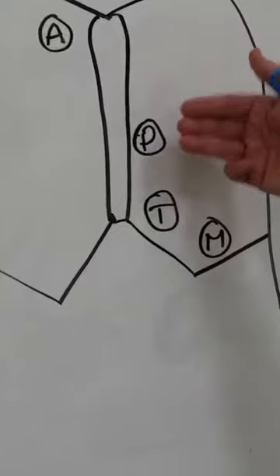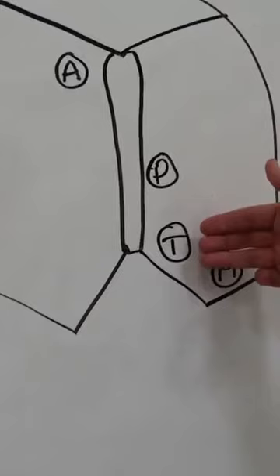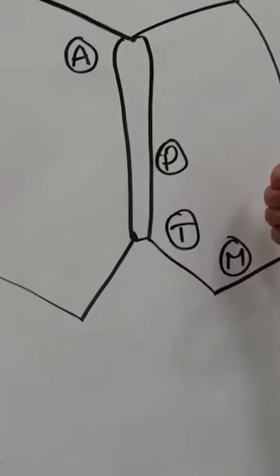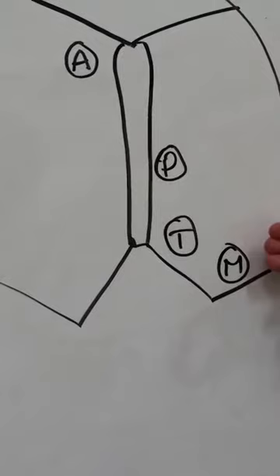We then move to the tricuspid listening post which is at the fifth intercostal space just to the left of the sternum. Finishing off our diaphragm examination with the mitral valve listening post, which is at the fifth intercostal space mid-clavicular line.